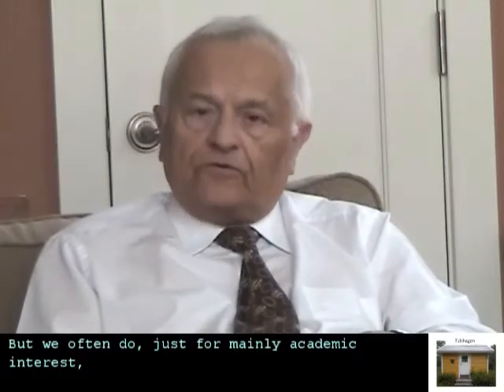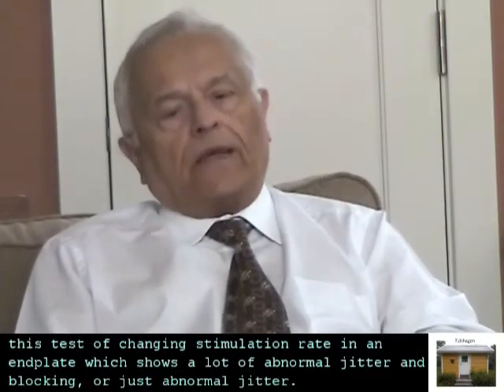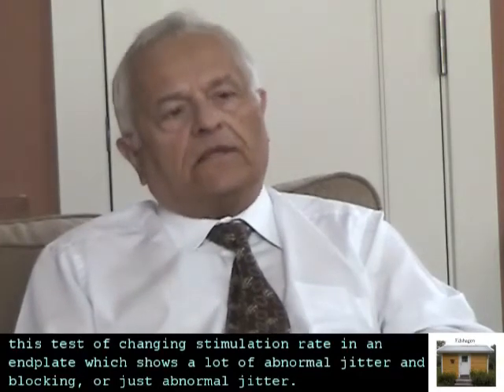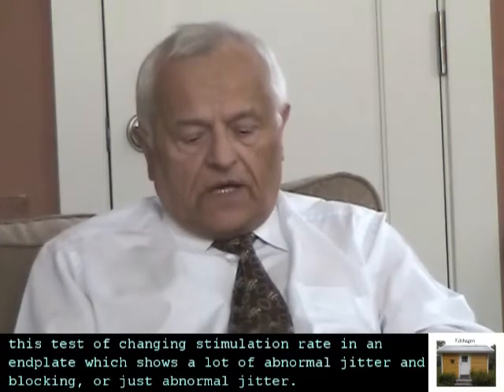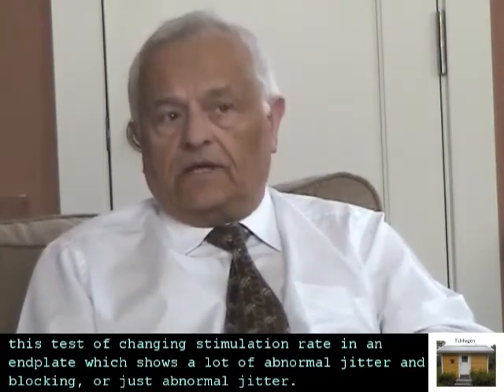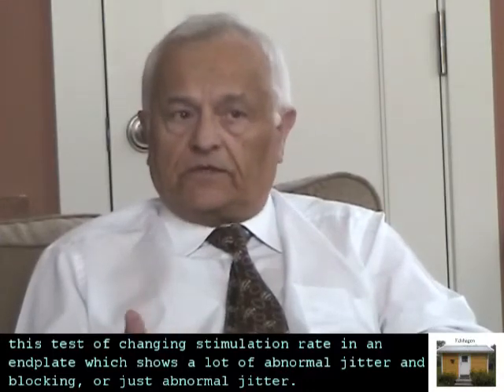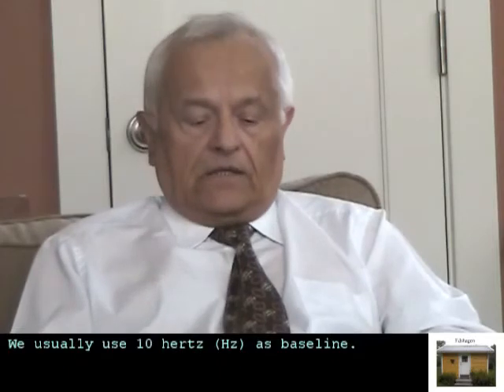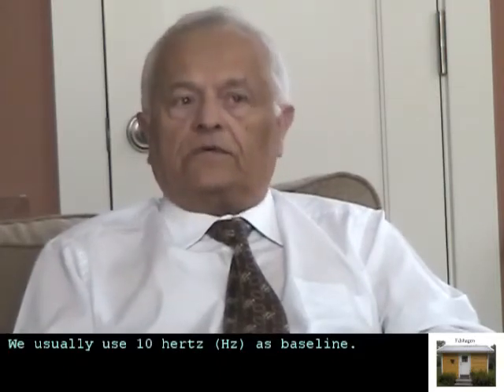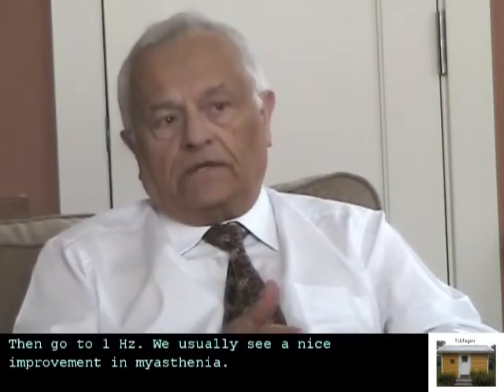But we often do, mainly for academic interest, this test of frequency, of changing stimulation rate in an end plate which shows a lot of abnormal jitter and blocking, or just abnormal jitter. We usually use 10 Hertz as a baseline, and then go to 1 Hertz.